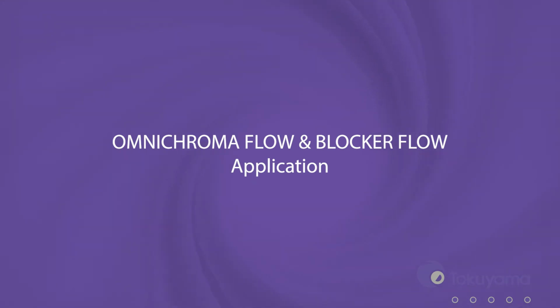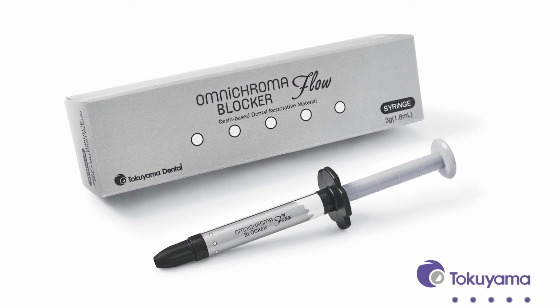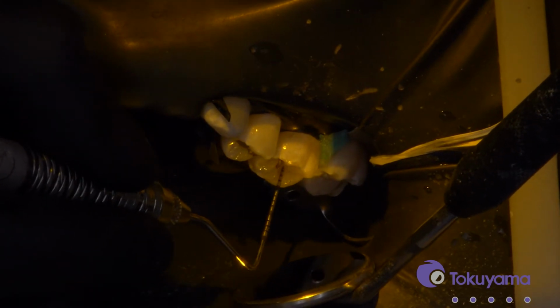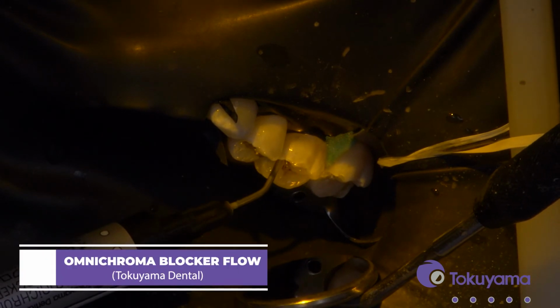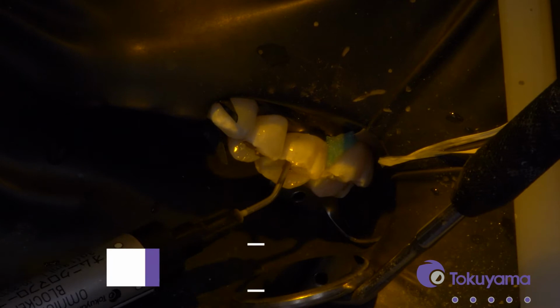So as I mentioned, we've got some discoloration of the tooth structure, and we're going to use OMNICHROMA Blocker Flow for this. This preparation is probably in the ballpark of 2, maybe 3 millimeters in the deepest. So as I'm placing my OMNICHROMA Blocker Flow, I know I need a good solid millimeter here. So if my prep is 2 millimeters, I know I have to go about halfway up. This is a material that needs to be incrementally placed.